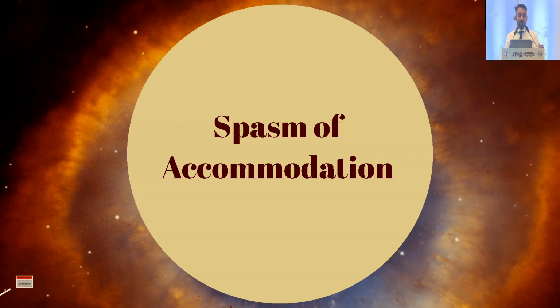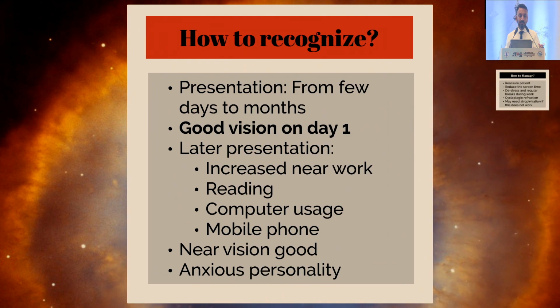Second cause, spasm of accommodation. Typically, the presentation can be from days to months. Typically, good vision on day 1 is the norm. Usually, they do not have such a spasm immediately on day 1.